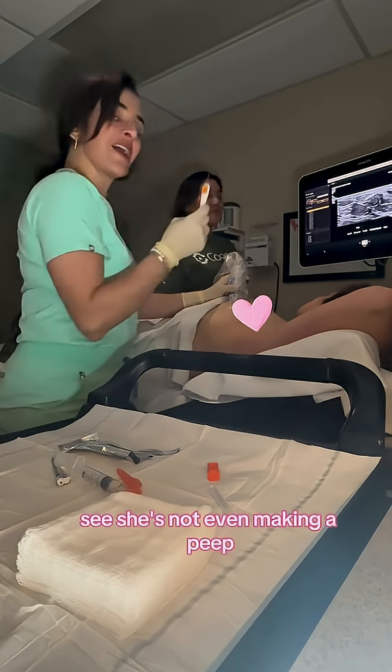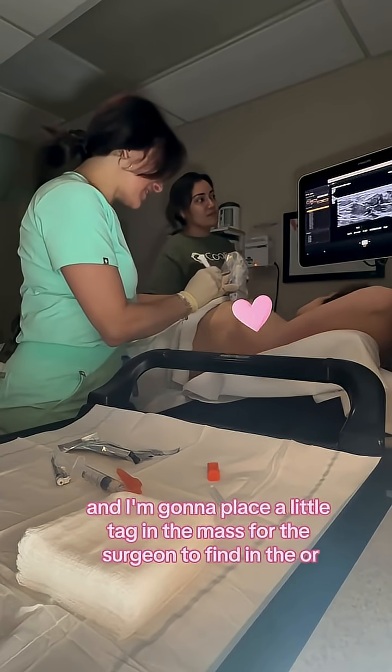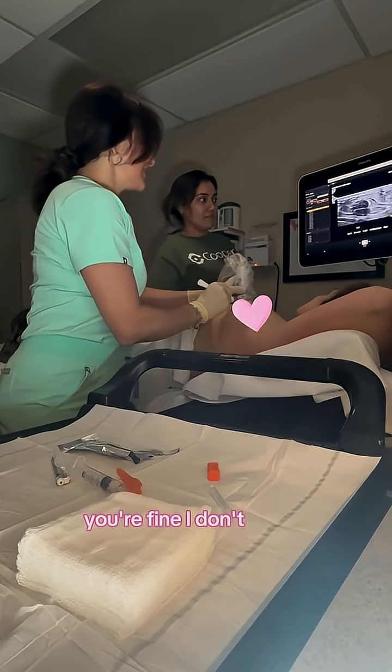She's not even making a peep. So this is the localization needle and I'm going to place a little tag in the mass for the surgeon to find in the OR. Lots of pressure here — I'm pressing really hard. Sorry. You're fine, I don't even feel anything.